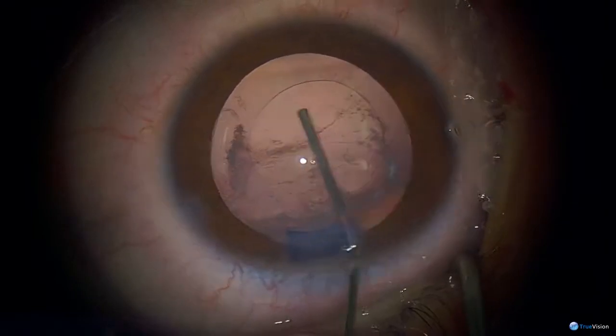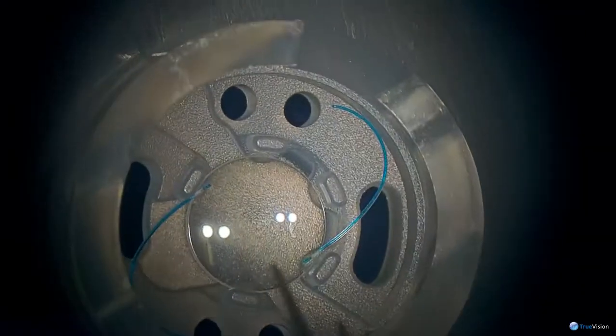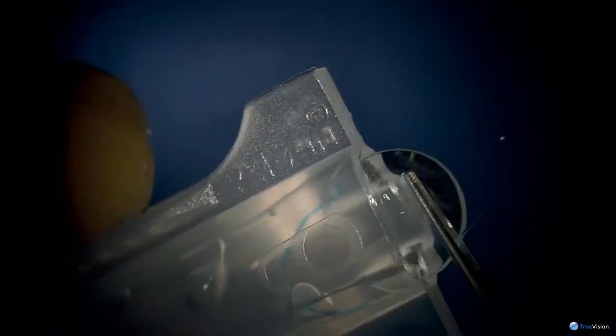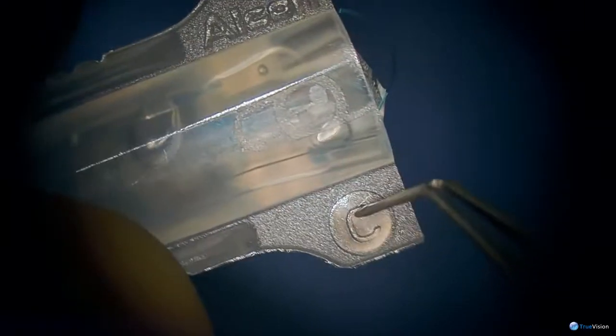We'll use the C cartridge. I tend to use these lenses in children because the haptics are thinner, and sometimes in children the capsular bag is too small. These lenses are not designed for injection, but they can be injected through a C cartridge — the tip is a little bit wider than the D cartridge, which we use for adults. You have to make sure the trailing haptic is underneath the injector like that.